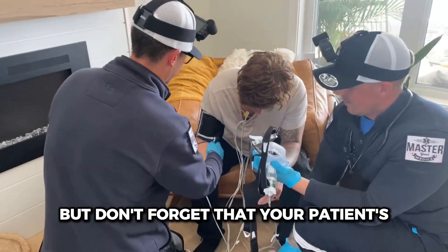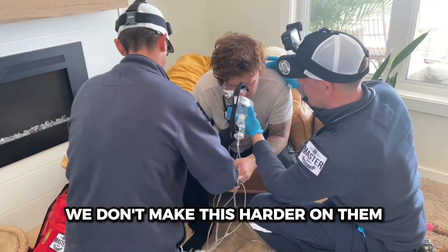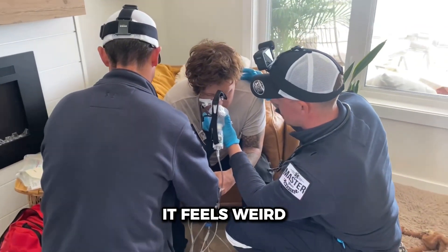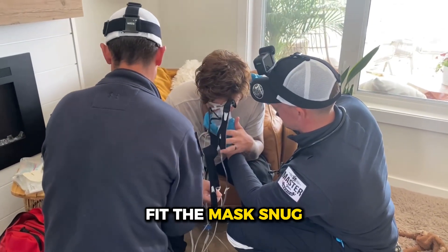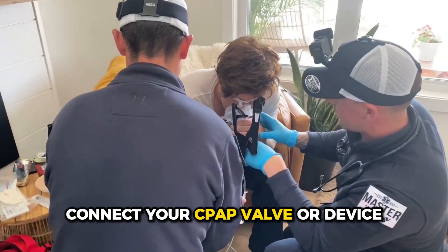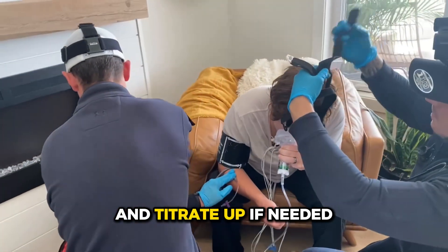Don't forget that your patient is already struggling, so we've got to make sure we don't make this harder on them. First, explain what you're doing to the patient — it feels weird and you need to warn them about that. Fit the mask snug over the nose and mouth. Connect your CPAP valve or device and start with low amounts of pressure at five centimeters of water, then titrate up if needed.